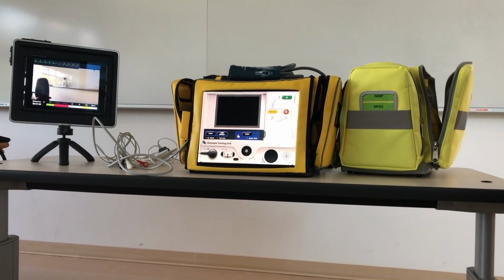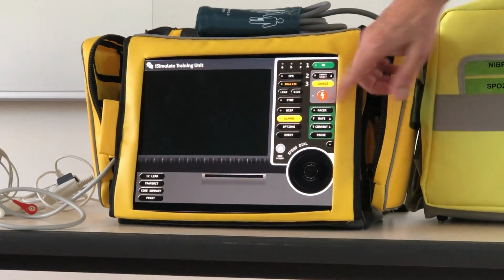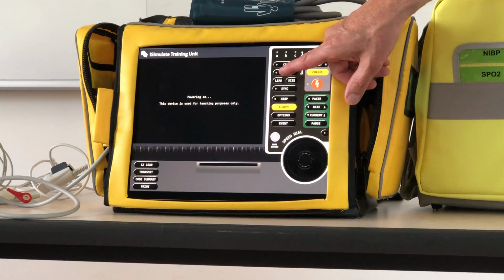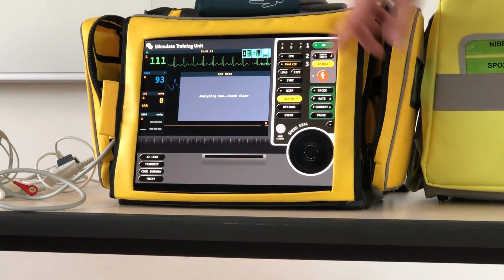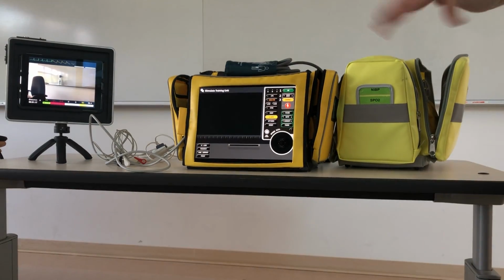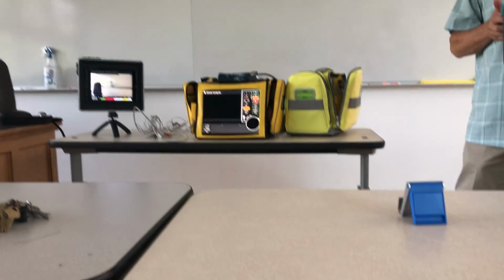But anyway, there are a few to pick from, and of course, if you're using a LifePak, you can also kick it into the analyze mode, and just wait till it turns on. Analyzing now. Stand clear. You can put it into AED mode and run it that way. So there's a few options for how you can do it for BLS classes, CPR classes, that kind of stuff.